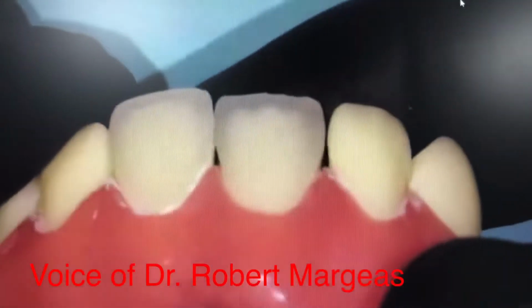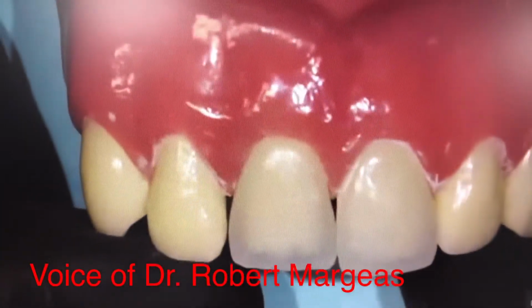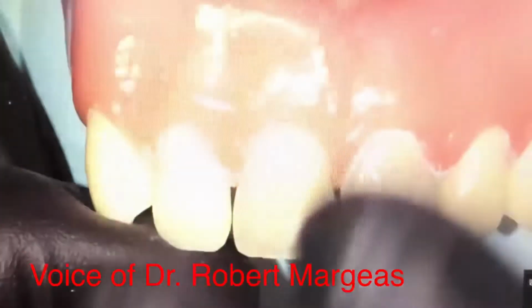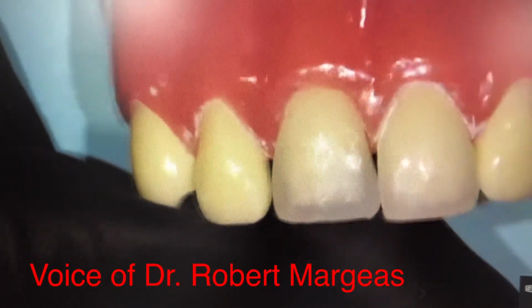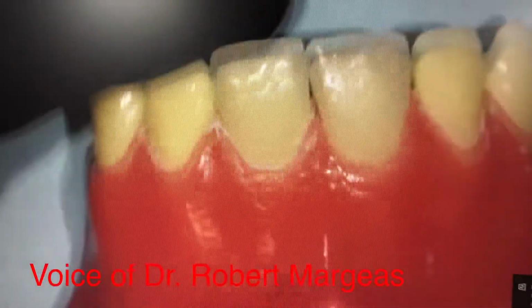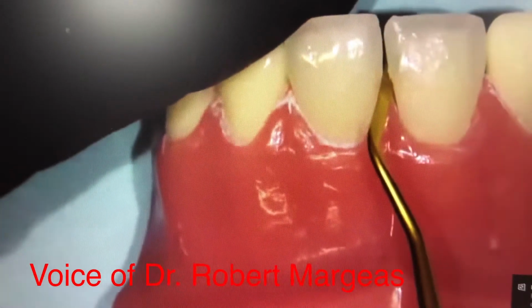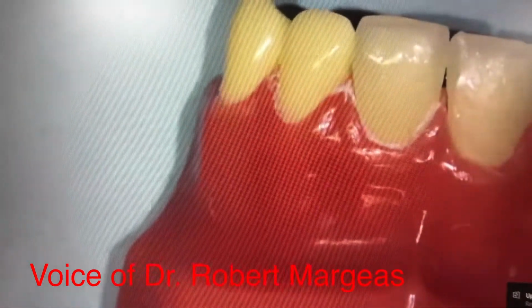Now watch what happens here when I light cure it. So now, look at the translucency. It looks like it has depth to it, okay? And then when I put my B1 on, I'll thin that out and it will tone down that translucency a little bit. That's how you create the translucency. And you tell the patient they're going to hear a little pop. You take a thick instrument and you do this. Pop. All right? No wedges, no bleeding, no overhangs.